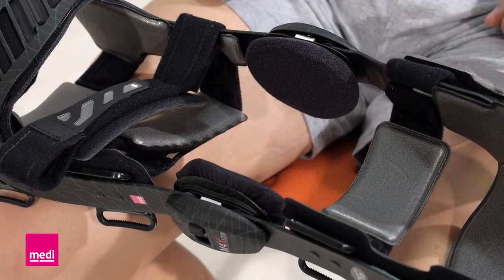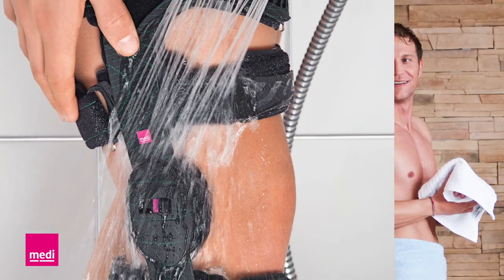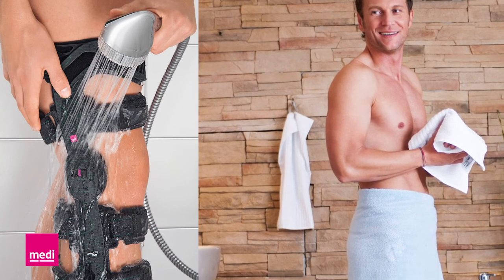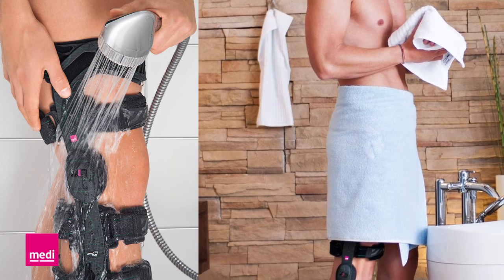The inner pads and condyle pads can be washed by hand in cold water and a mild soap solution. Leave them to dry in the air. You can also wear the Medi M4 X-Lock orthosis in the shower. Please make sure, though, that the injured knee is always kept straight and the orthosis hinge is locked.